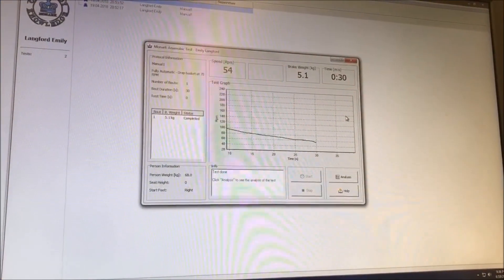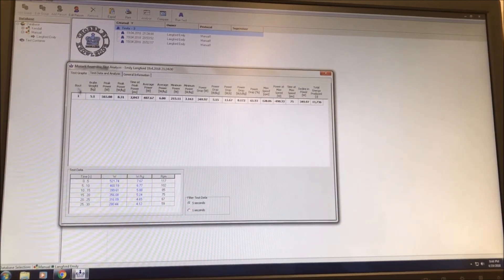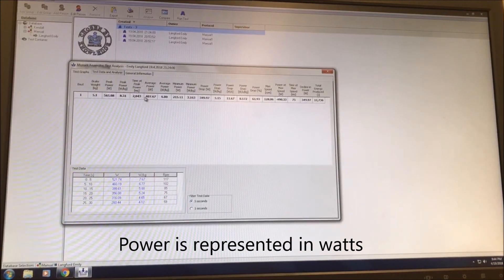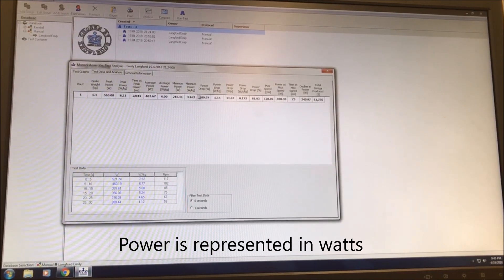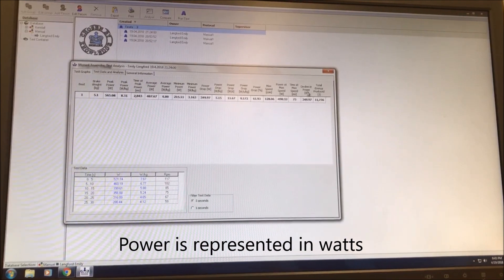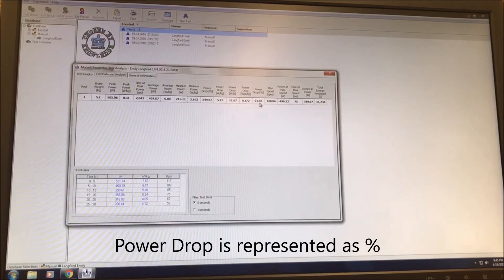Now that the participant has completed testing, we will come down here to analysis — this is represented as power over time. We can come here to test data and analysis, and this shows variable by variable how the participant did. Her peak power was 565 watts. Her average power was 407 watts. Minimum power was 215 watts. Her power drop was 349 watts. Her decline in power was 349, and her fatigue index was 61.93.